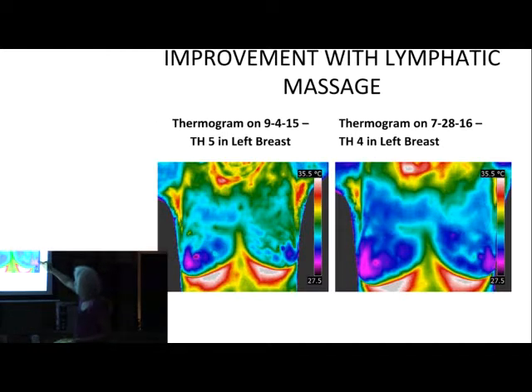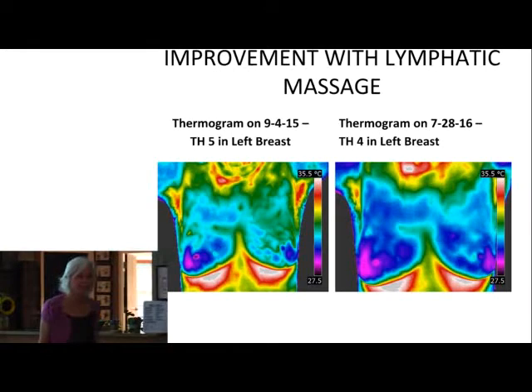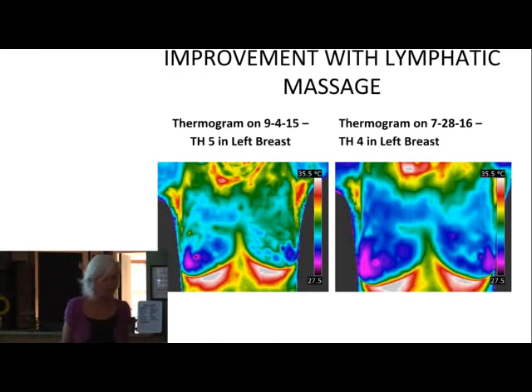So if we find an area of hot pink in one breast, and in the same area of the other breast is dark blue, that's probably not going to be significant because that's close together. But if we find an area of hot pink in one breast and we find in the same area of the other breast yellow, well, that's got to be investigated. There could be some heat difference there. So she has more green. You can see that over that left breast, right?